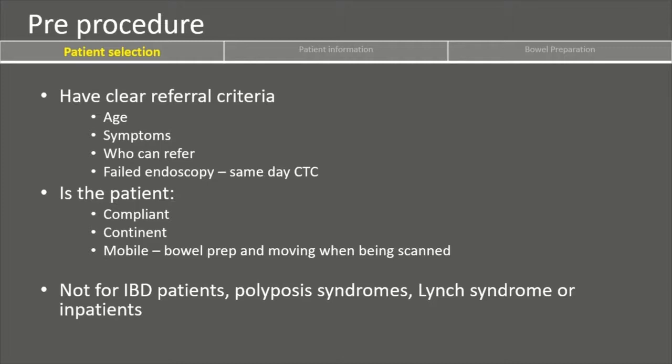And how mobile are they? Again, this relates to bowel preparation. Will they be able to go back and forth to the toilet on multiple occasions? And also when they're actually being scanned, will they be able to be moved into the appropriate positions?